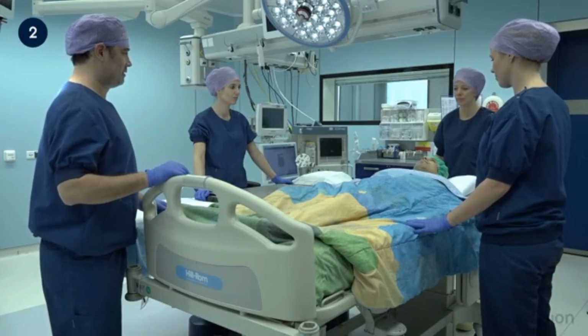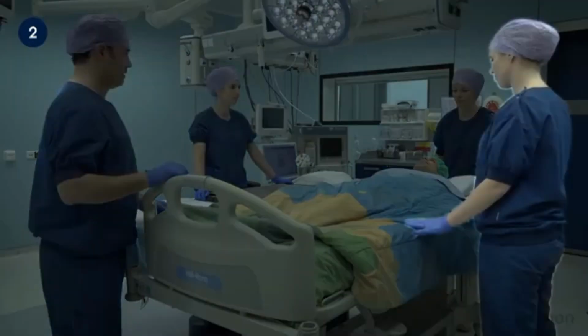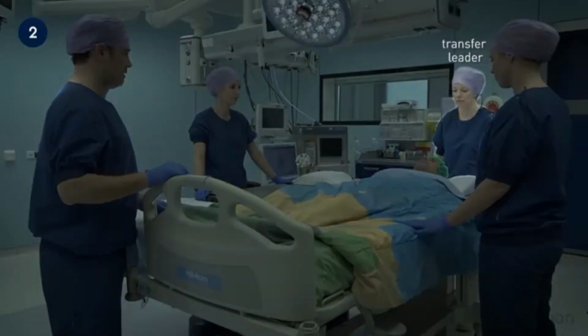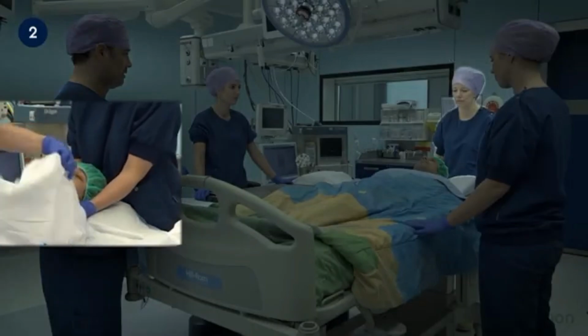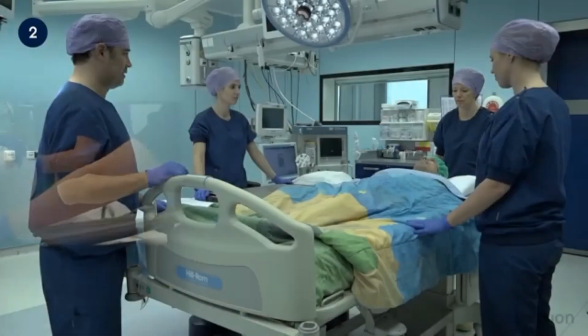Typically, patient positioning begins with transfer from the patient's bed onto the surgical table. If the patient is unable to transfer themselves, 4 members of the OR team are required for the transfer. The actions of the team are typically led by the person at the head. In many hospitals, this transfer leader is anesthetically trained.